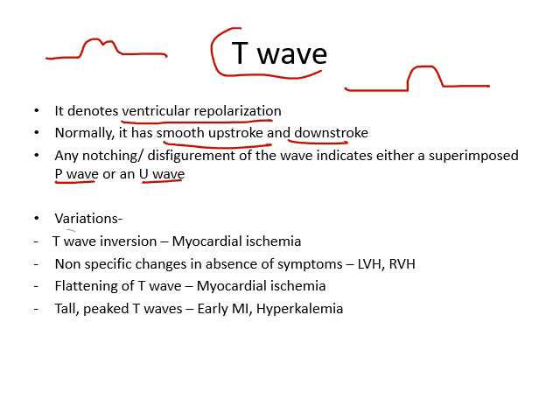Number one is T wave inversion. So, if you are getting symptoms suggestive of myocardial ischemia like chest pain, shortness of breath, chest tightness, or chest pressure, and you see an inverted T wave, you should do aggressive workup to figure out the cause of symptoms. It is very likely that the symptoms are due to myocardial ischemia, and a timely intervention can save the life of the patient.